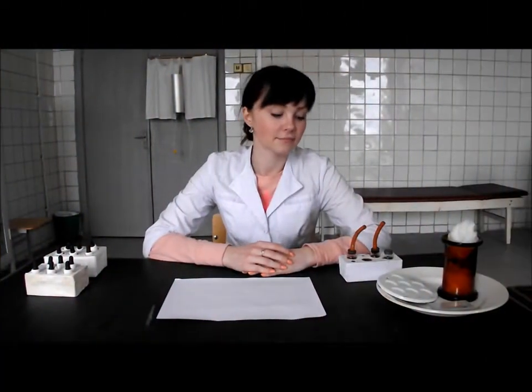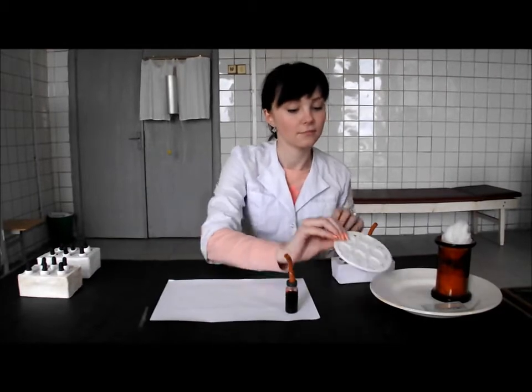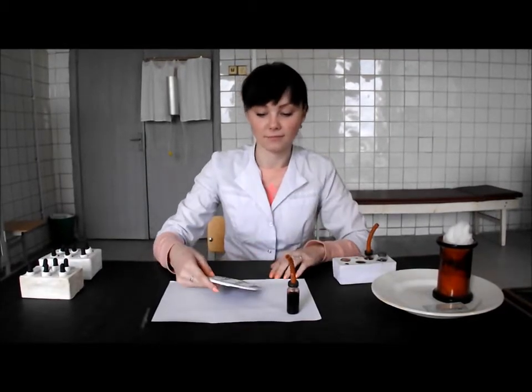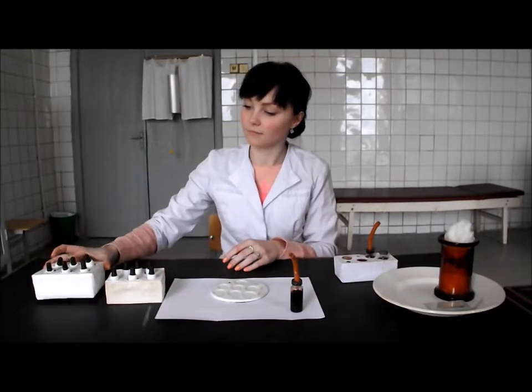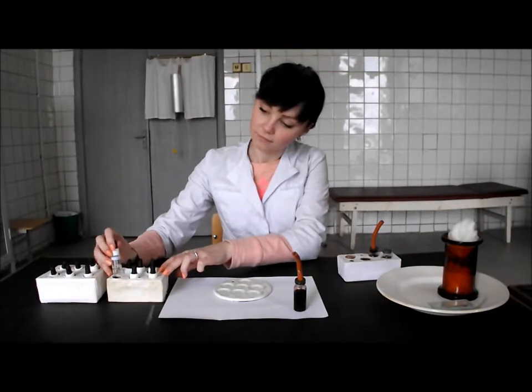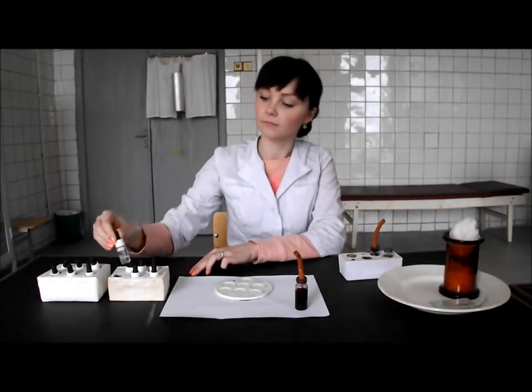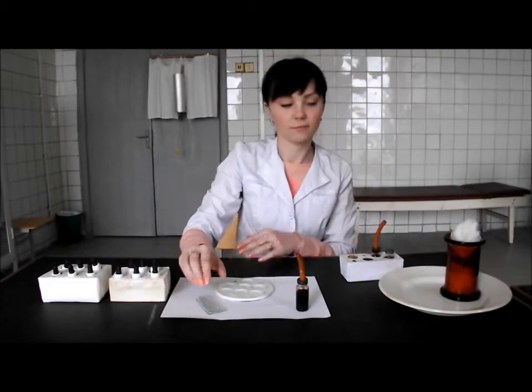For the work we need the stabilized donor blood, laboratory dish, standard sera of the first, second, third and fourth blood groups of two different series, the isotonic solution of sodium chloride, slides, and cotton wool.